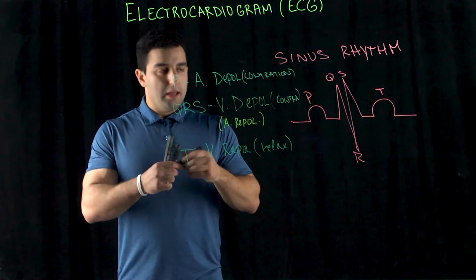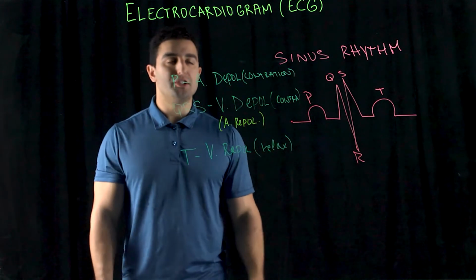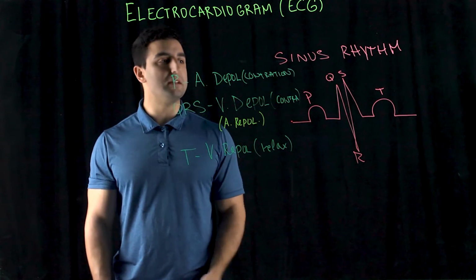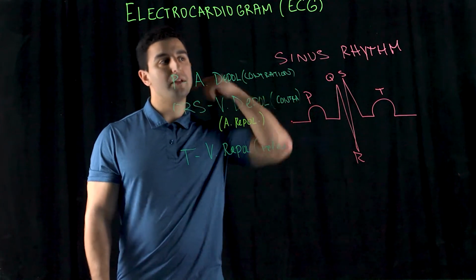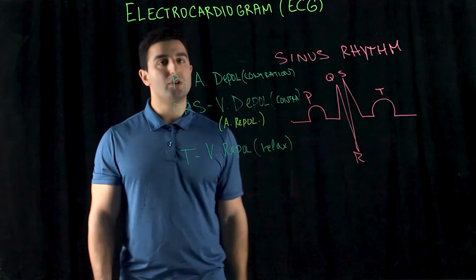Okay, so the electrocardiogram is used to indicate any kind of blockage of conduction. So instances of cardiomyopathies, myocardial infarctions, ischemic-related conditions involving the vascular system, specifically the heart, can be measured with the electrocardiogram, right?